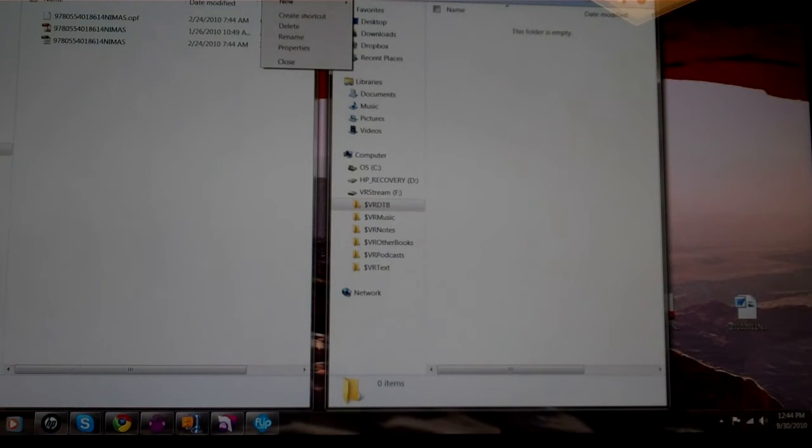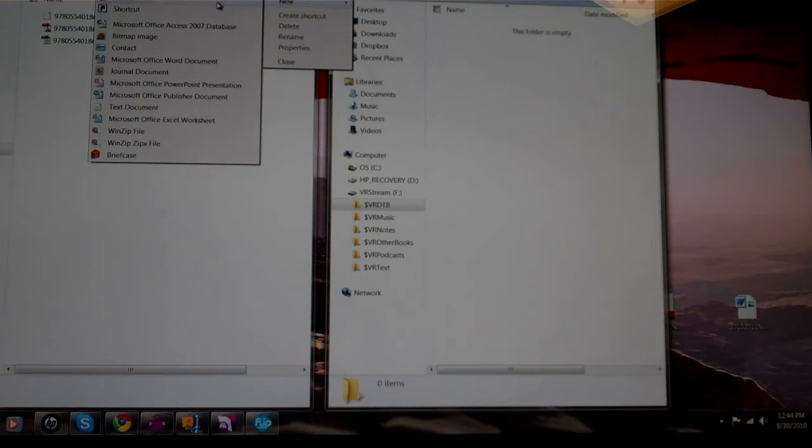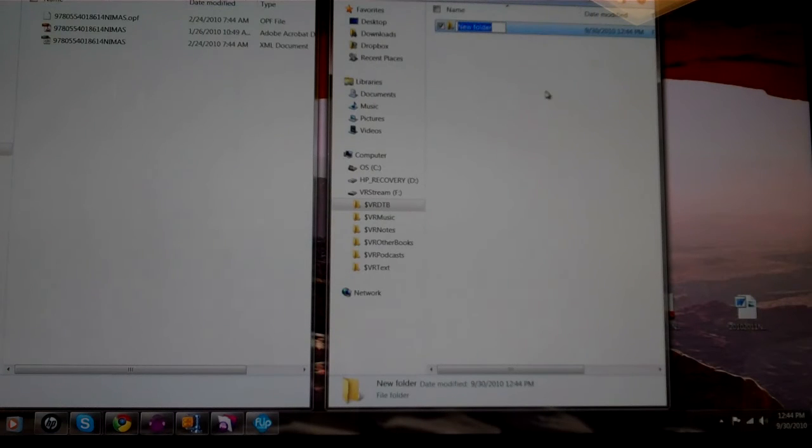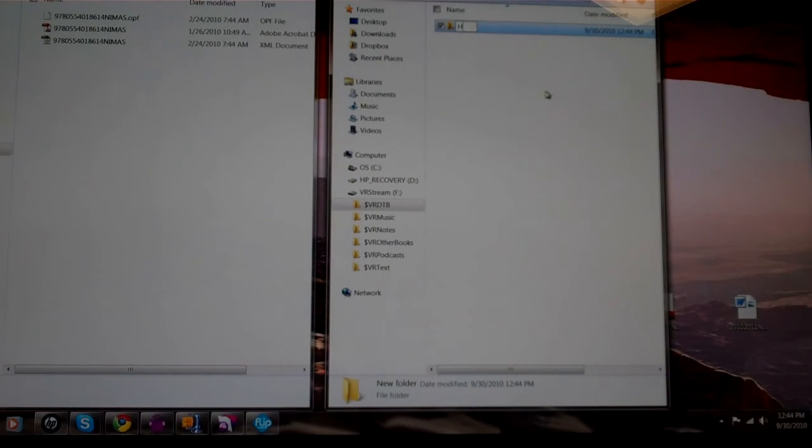Now we'll want to make a new folder here so that we can keep our books organized. So we'll make a new folder here and this is a history book. So we'll call it history.